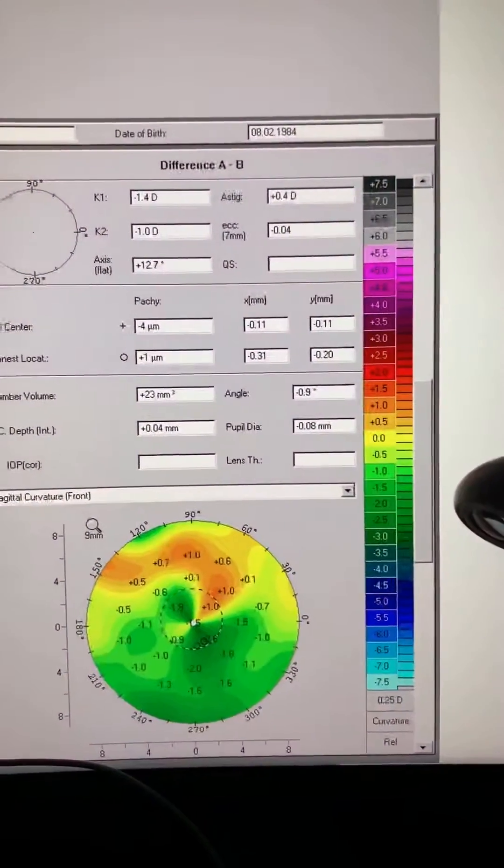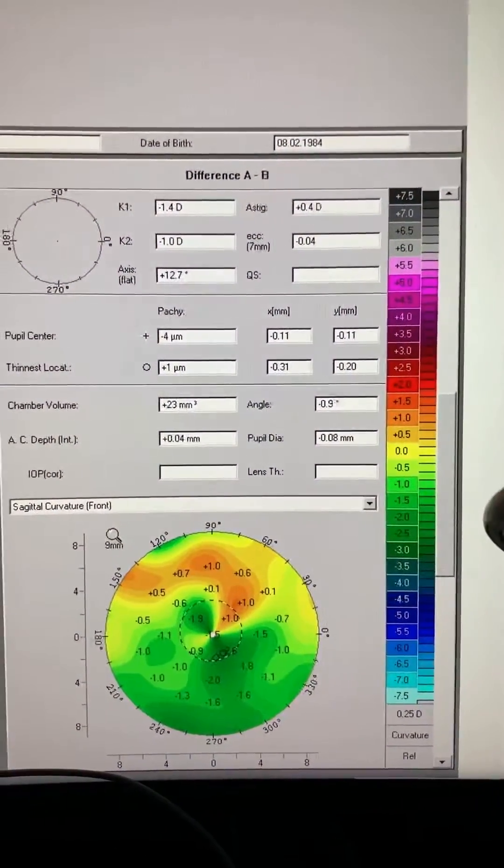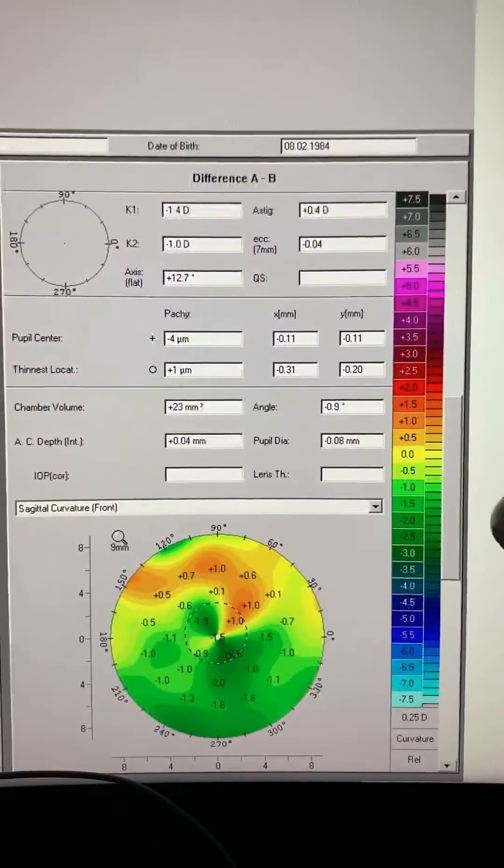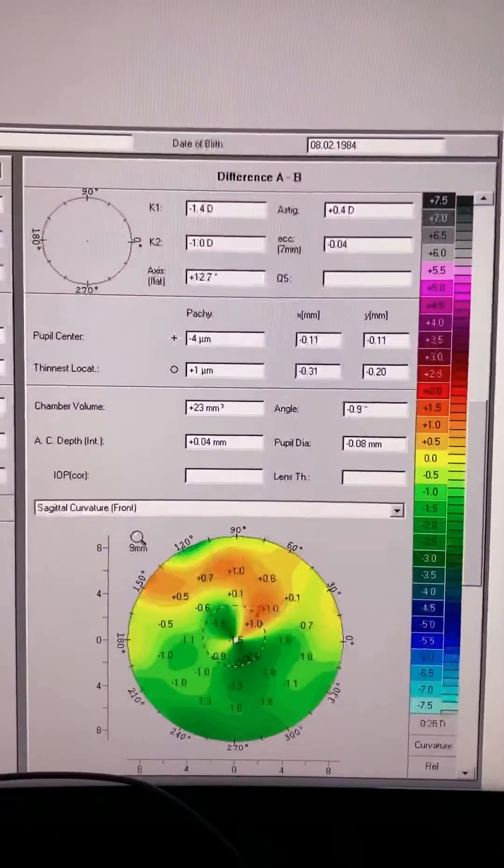Now let's look at the other eye. We saw the first eye, which was the left eye.